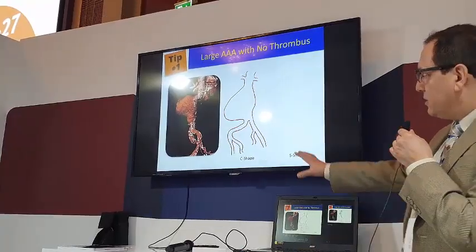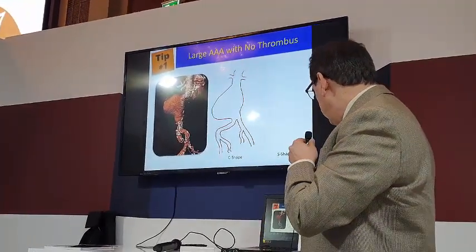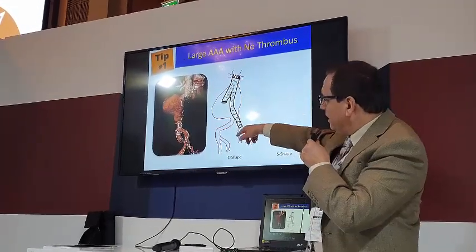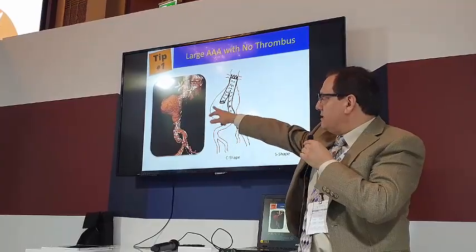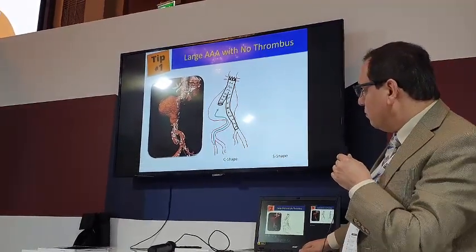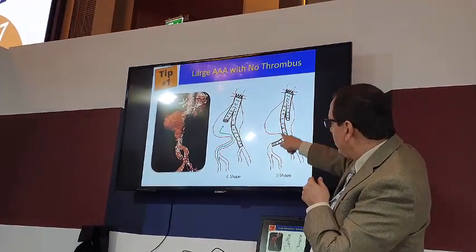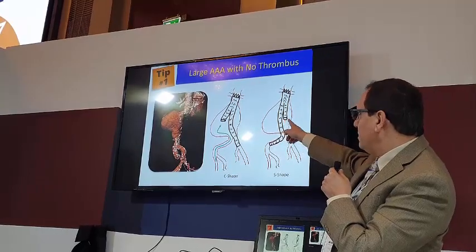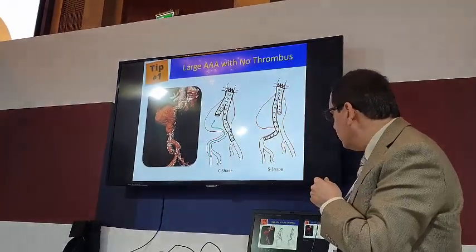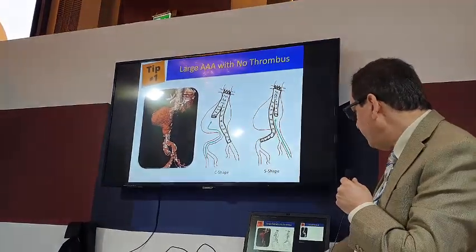What do you do if you have a large aneurysm like that? You have a big sac here. If you deploy your device in what we call a C shape, from the left side, your contralateral limb will be inside the sac, so it will be very difficult to cannulate. If you instead deploy an S shape from the right side, the contralateral limb will be between narrow areas and easier to cannulate. So this is tip 1. With that information, you can decide which way to go.